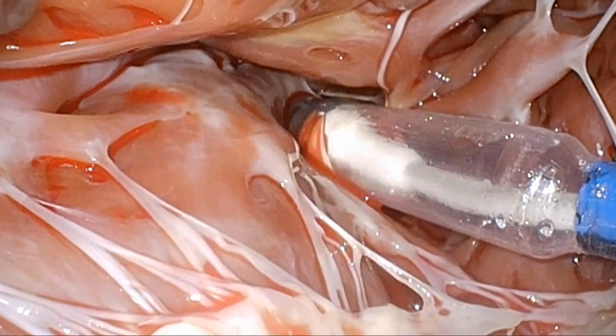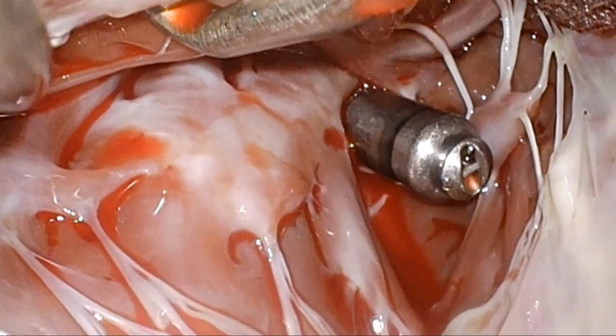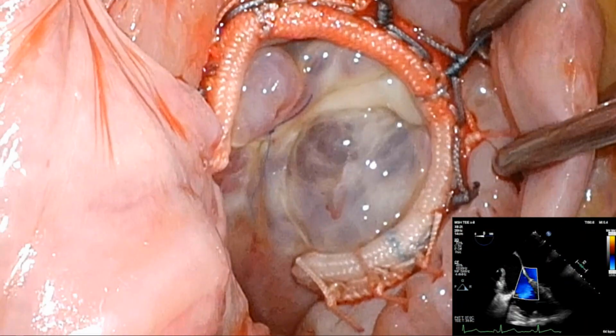I'm just showing this video to show that we use leadless pacemakers at Mount Sinai a lot because, as the previous speaker said, you should never pass any wires across a repaired tricuspid valve because now you're jeopardizing the long-term durability of the repair. Now they have leadless pacemakers with even an AV synchrony feature.